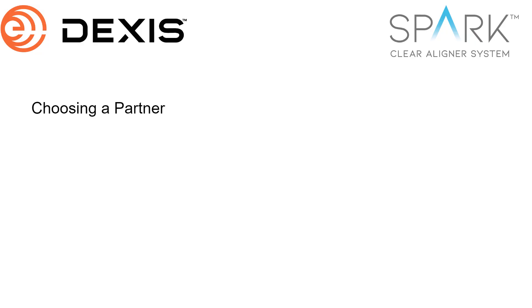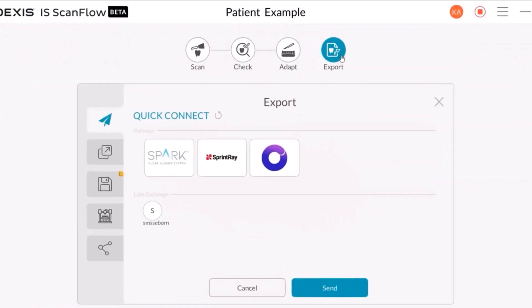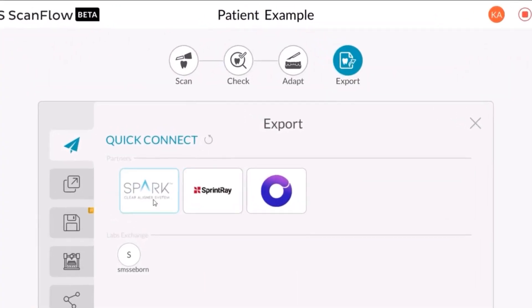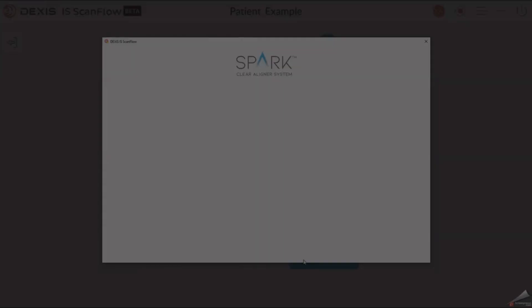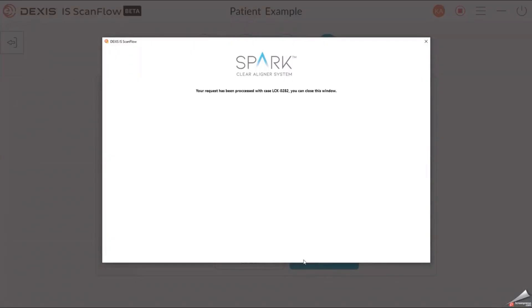In the Partners window, select Spark and click Send. Dexis IS ScanFlow saves the data and sends it to the Spark Portal. The Spark Request Has Been Received window will be displayed with a case number. Click the X to close the window.